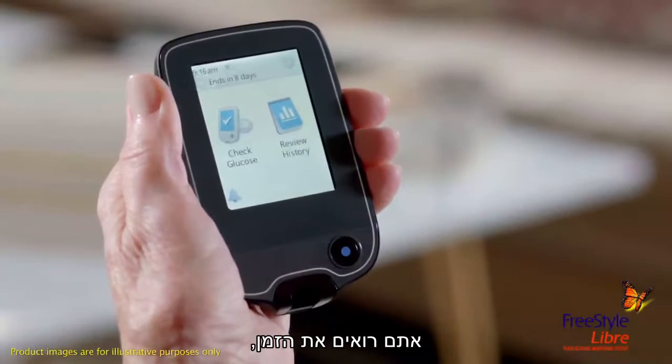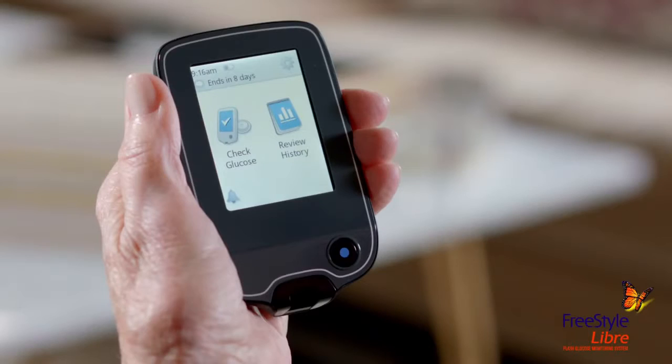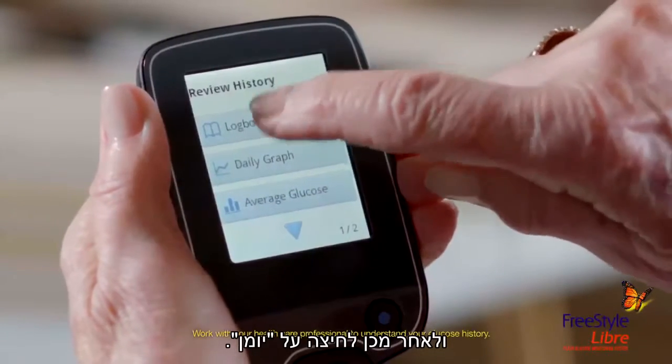You see the time, the battery life, and the number of days till you have to change the sensor. You can even see all of your past glucose readings by tapping the Review History icon, then tapping Logbook.